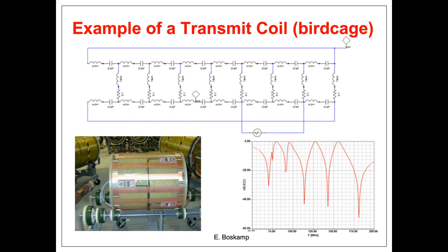One of the classic transmit coils, and by the way, I forgot to mention this, a lot of times these coils can also be described as antennas too. Whereas the microwave engineer thinks of an antenna as a dipole or a Yagi, sometimes that same terminology is used in MR when it's referred to as an antenna, but it's really a coil. But that's changing with high fields, and I'll talk about that a little later.